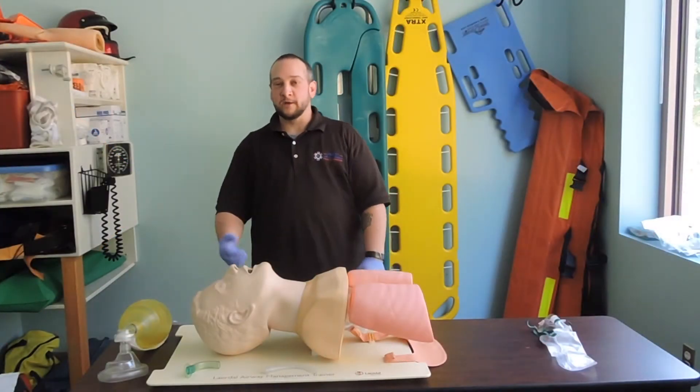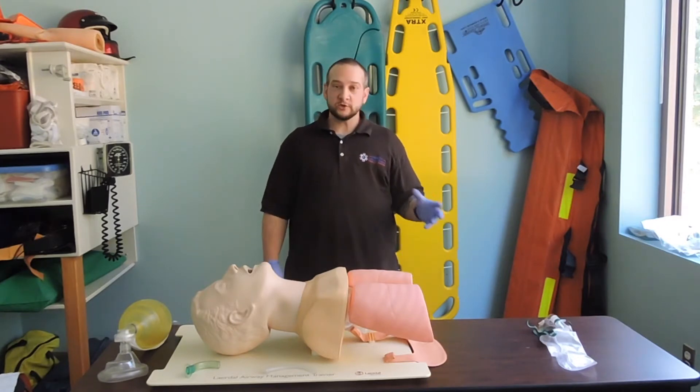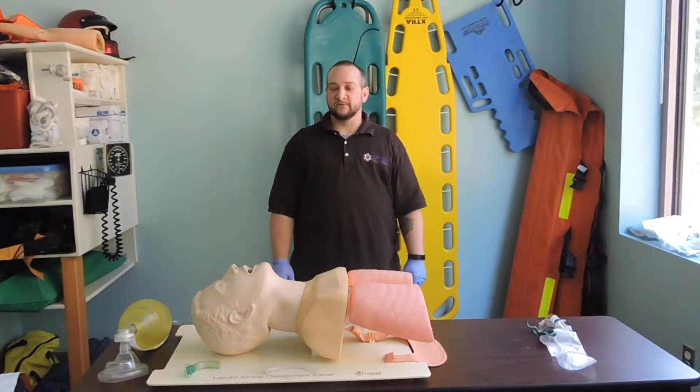I'm the BLS coordinator and one of the paramedic instructors here at NMETC. Today we're going to do a brief demonstration of the equipment, show you what it is, how it functions, and go over basic BLS airway management for our patients.